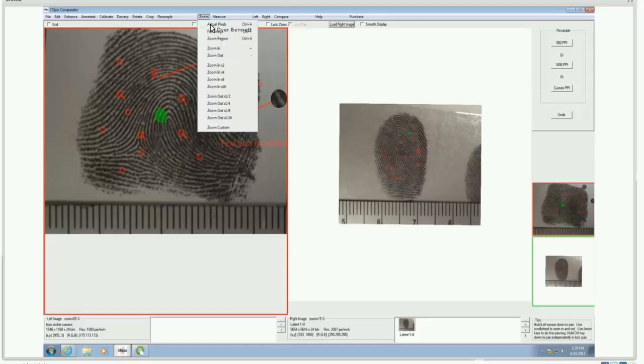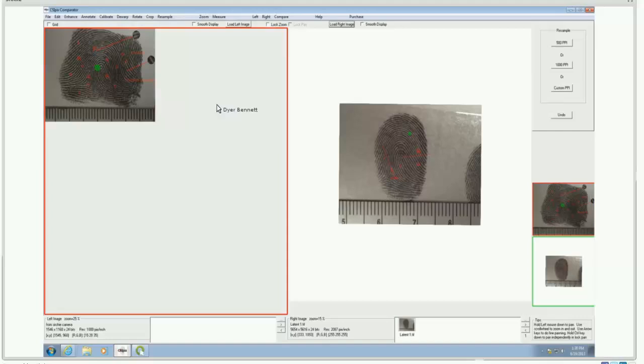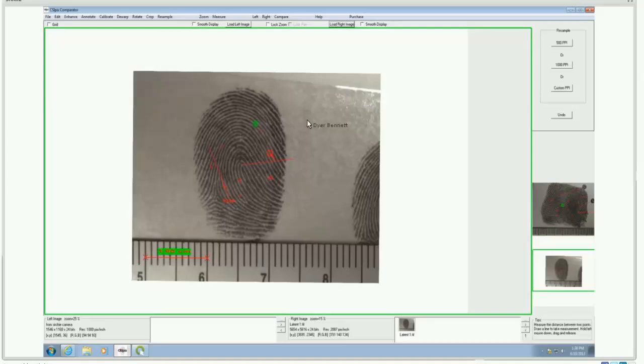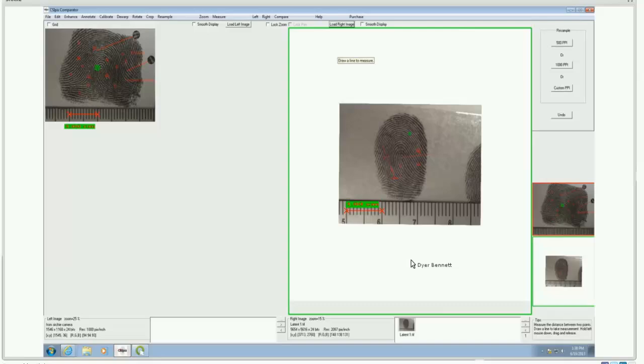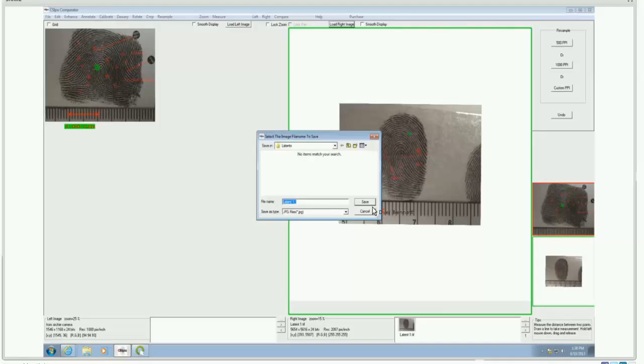The zoom function mirrors what you get with the mouse scroll, offered as a menu feature — you can zoom 2x, up to 16x, and zoom out. The measure function, as covered earlier, allows measurement within the image. You can also view just the left image, just the right image, or go back to comparison view. All of this can be saved with or without annotations.